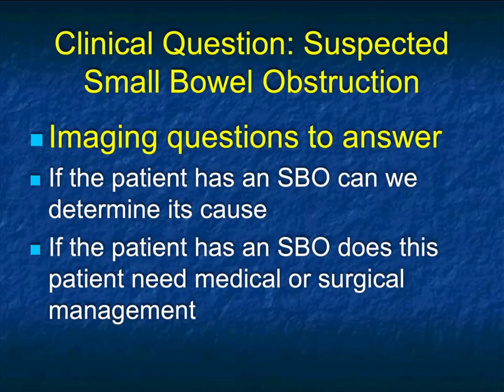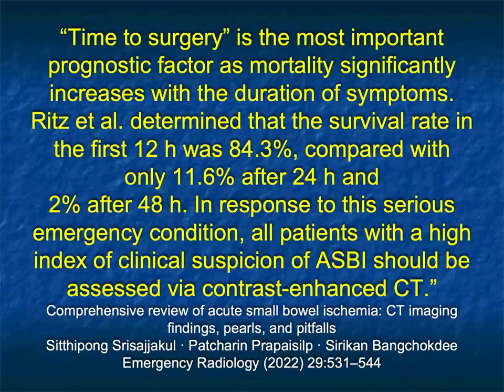So much of what we do in CT, and this is going to be true as AI comes along, I think what AI is probably going to do is help us predict how we should manage patients based on a set of symptoms, clinical as well as imaging, putting it all together and making decisions. But that's the biggest decision: watch the patient or take the patient to surgery.